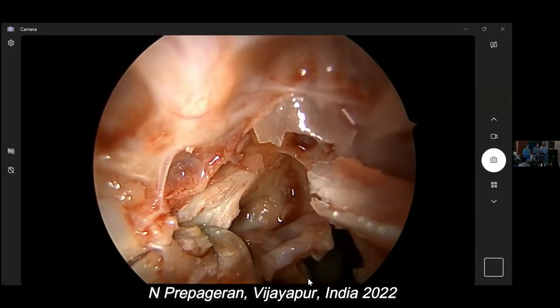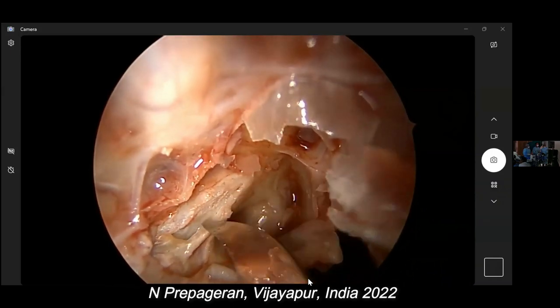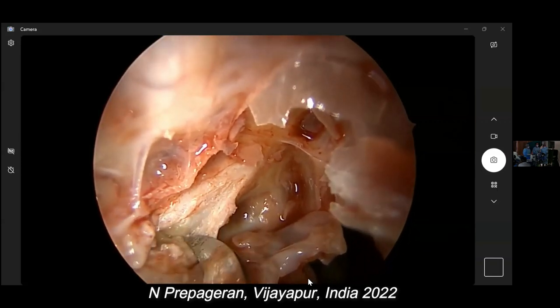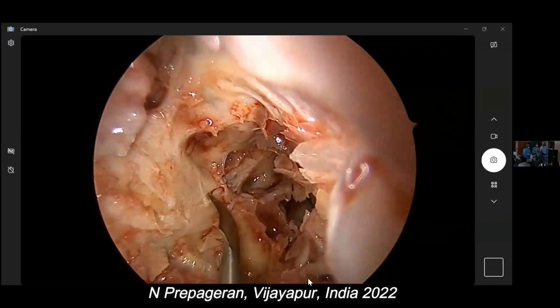There, that's the nerve. Oh, blood. Can you see how much you need to cut before you can see the nerve? Clear, guys? Yes, sir. To injure the optic nerve is not easy. You see how much you need to cut? Okay, now I'm going to open up the periorbita.